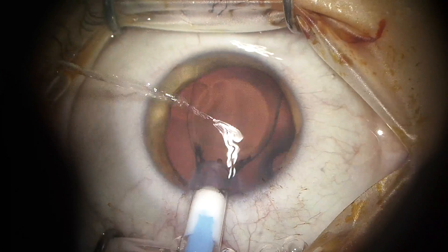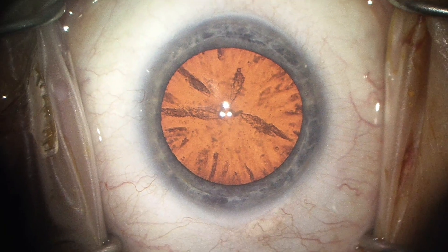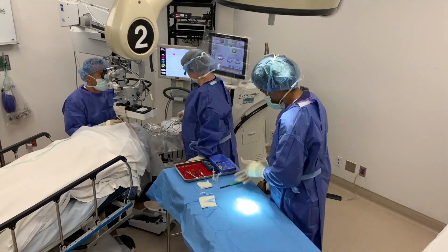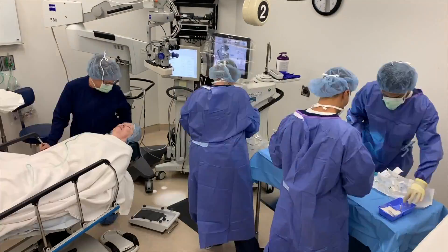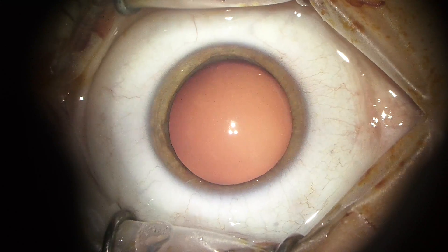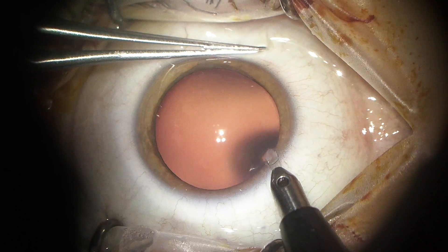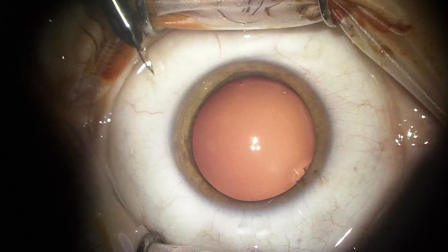Today we're going to talk about the implantable contact lens. This is Dr. Marcos Reyes and I'm excited to share this procedure with you today. It's called the Visian ICL, or implantable contact lens — that's what the ICL stands for. It's made by a company named STAAR Surgical.